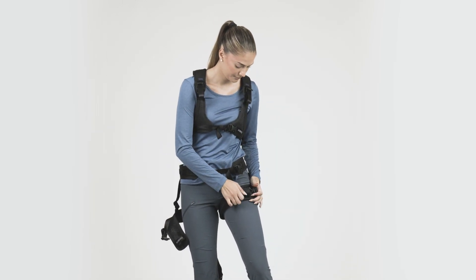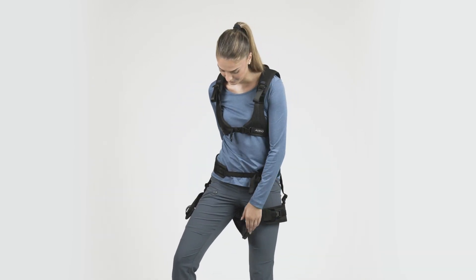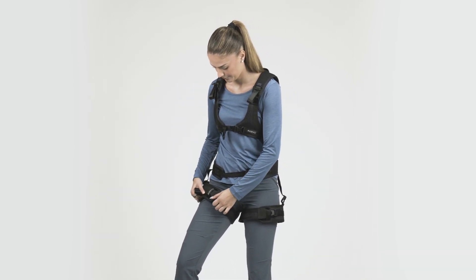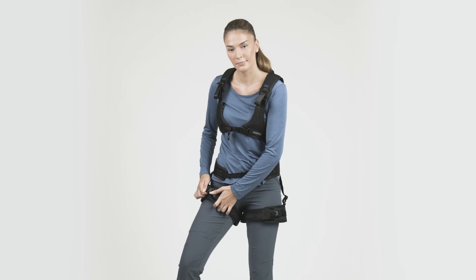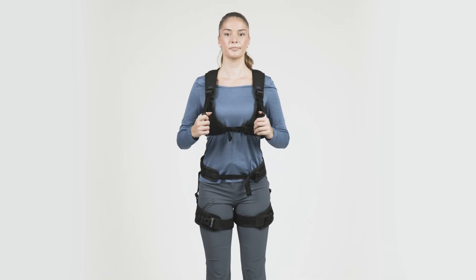When activated, the LiftSuit provides back and hip support during forward leaning and lifting movements. As you can already see, using the LiftSuit is easy. With a bit of practice, it can be donned, adjusted, and used in 30 seconds.